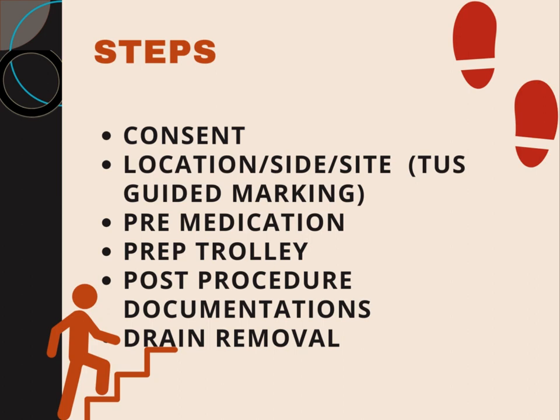And then the last thing would be drain removal. If you have achieved your goal, the patient has resolved in terms of pneumothorax or pleural effusion, then what will be the stage of drain removal? How will you be confident, okay, this is the point, you can safely remove the drain?